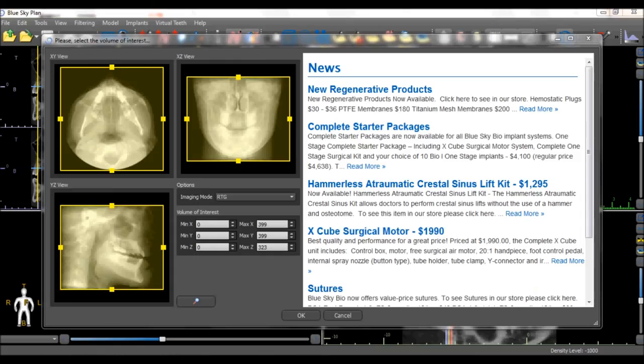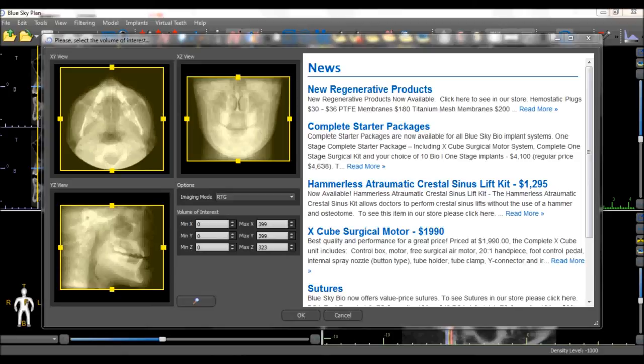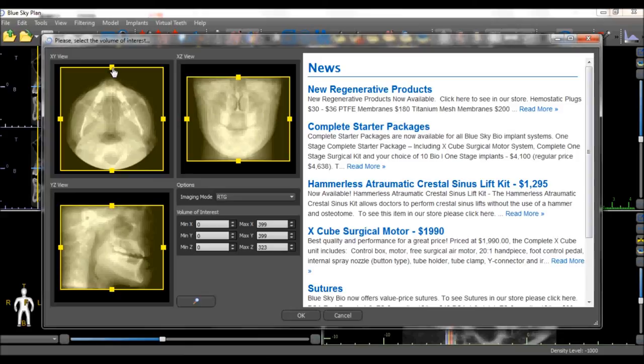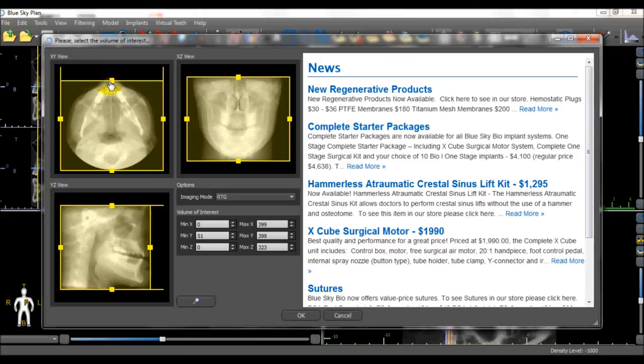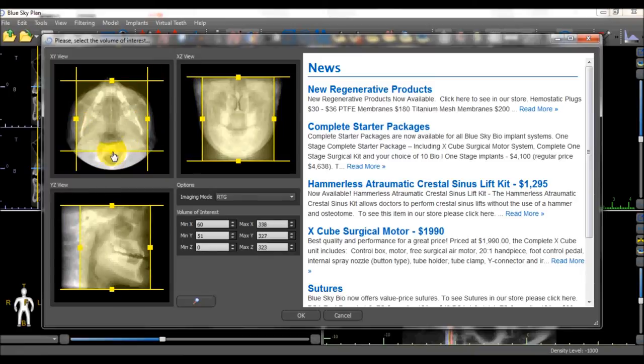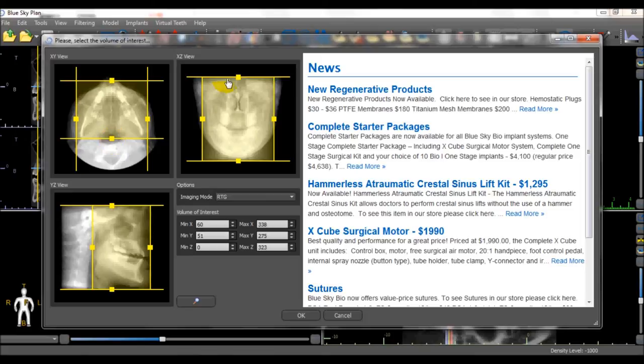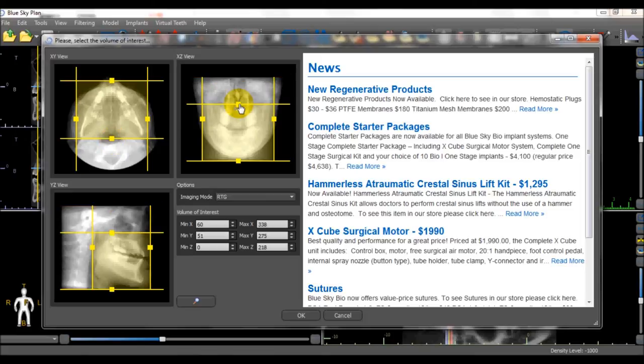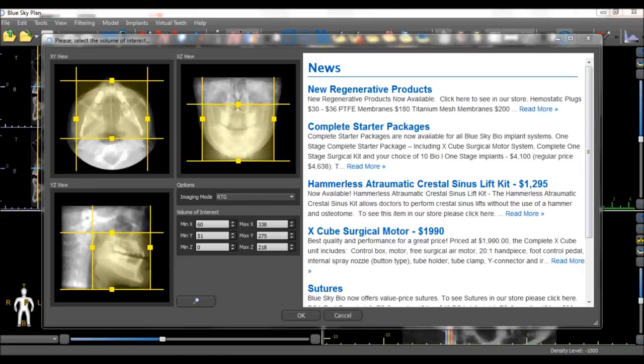The next and final dialog box which opens to load the DICOM images allows us to define the field of view. Any of the squares on the borders can be grabbed and dragged to define the relevant field of view. This is important as it allows us to focus on the relevant area of interest and does not cause your computer to process any unnecessary data.